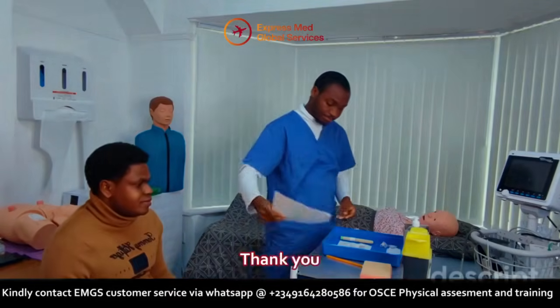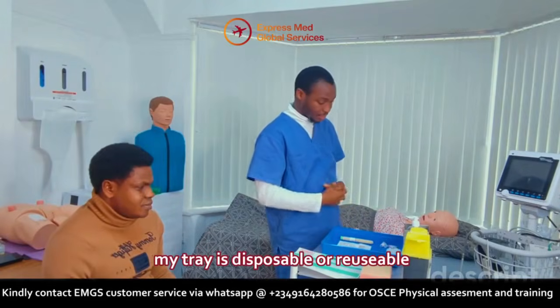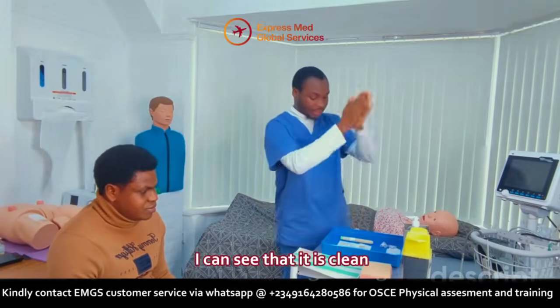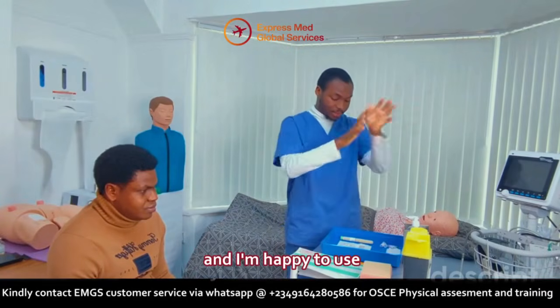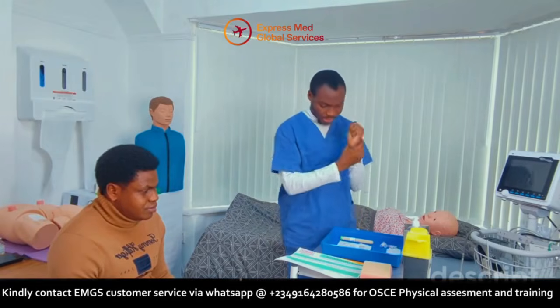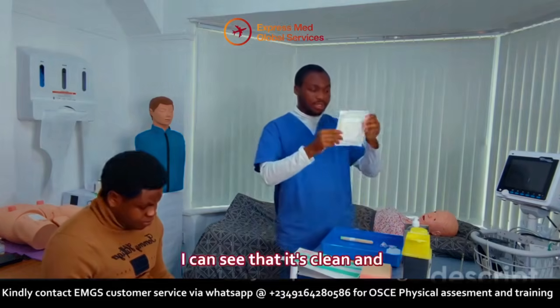That's fine. Thank you. Assessor, I want to confirm if my tray is disposable or reusable. Yeah, disposable. I can see that it is visibly clean, and I'm happy to use. So I have my equipment here with me. I have the balls. I can see that it's clean and it's intact.